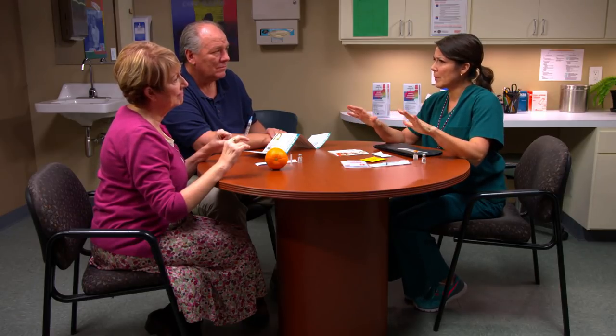So after you've used the naloxone, it's important to make sure you dispose of it in a safe way to reduce the risk of transmitting viruses through accidental needle sticks. Do you remember how to dispose of needles properly? I put my needles in a sharps container. Great. And if for some reason you don't have access to your sharps container, you should follow your community's hazardous waste collection instructions, or you can give it to an ambulance crew member.